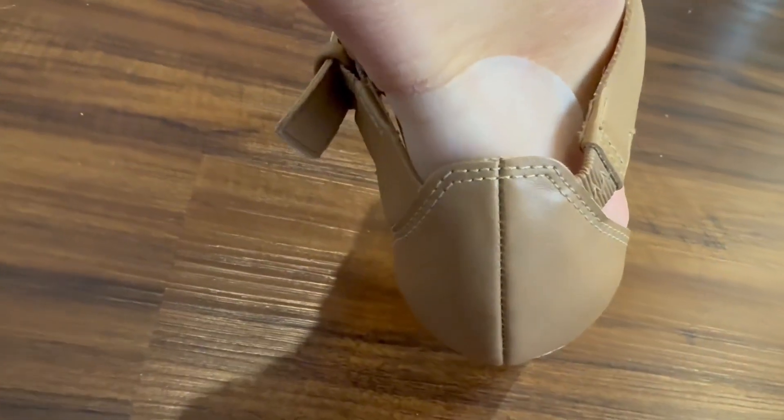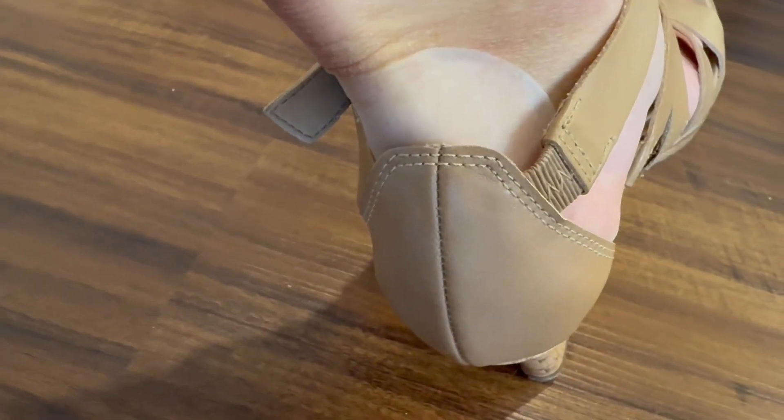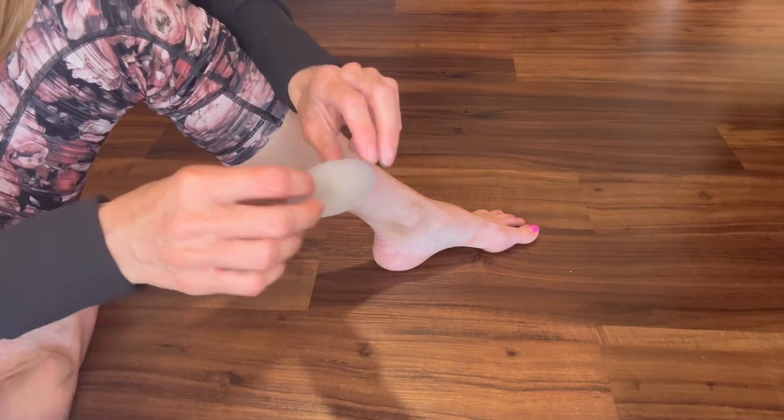They're also fantastic for preventing blisters, especially when you're wearing shoes that are uncomfortable or a little bit on the tighter side. These bandages are so easy to use and the best part is they stay put. When I get a blister on my foot, it's usually on my heel and I've had the hardest time finding a bandage that will stay in place.